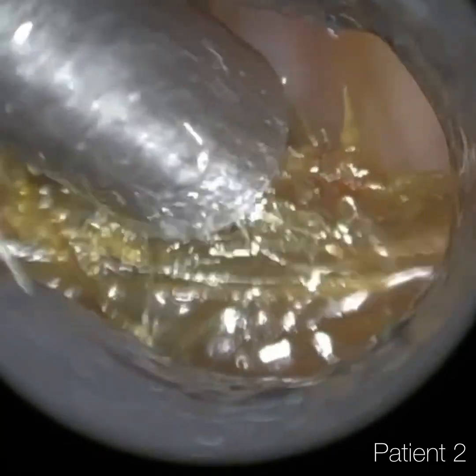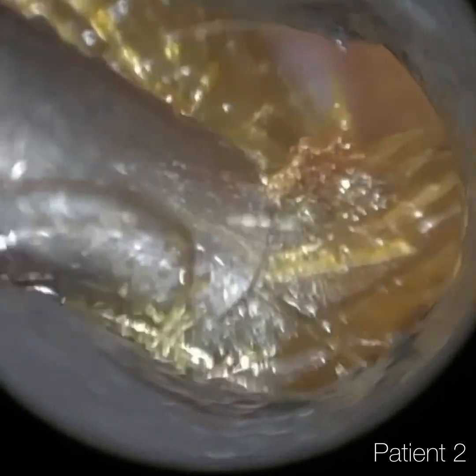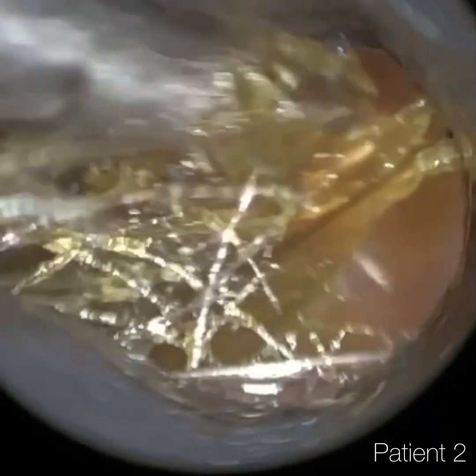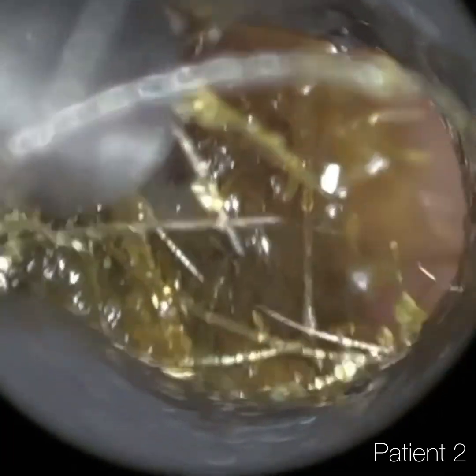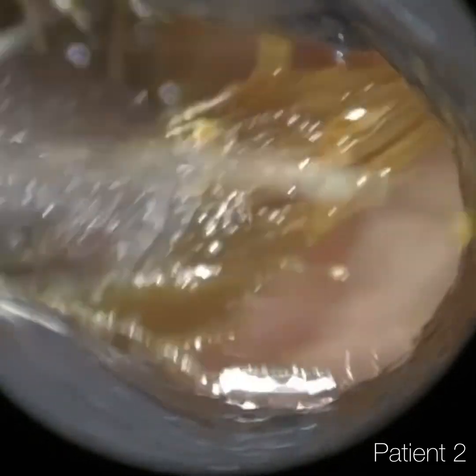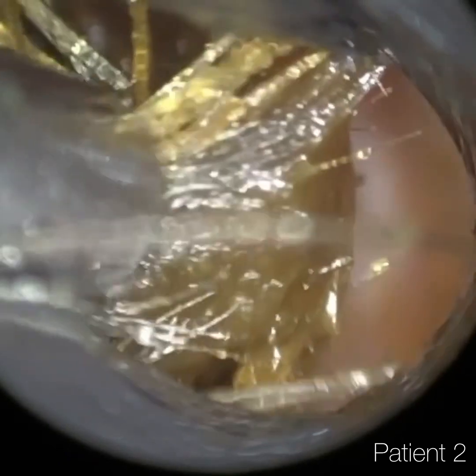Just look at that clarity of the suction probe — and that's what's great about the Waxscope. You're seeing the instrument, and that's key. If you're removing earwax, you want to be able to see not only the wax but the instrument crystal clear, so you know where you are in the ear. You don't want any distortion bumping into the ear canal and making it uncomfortable for the patient. So I'm just going from the bottom upwards, just trying to lift it off the canal wall because it is stuck to the bottom.